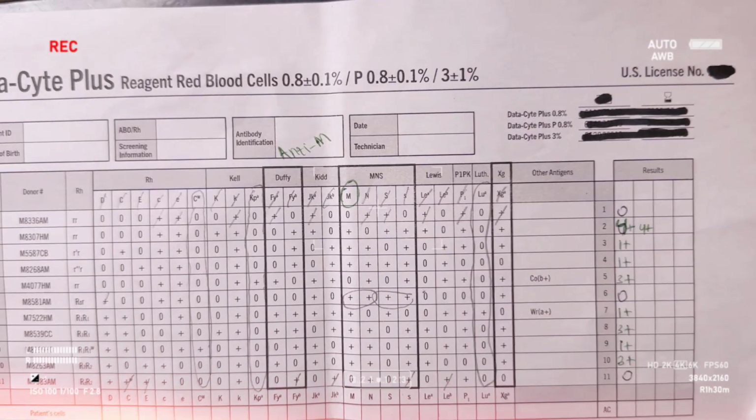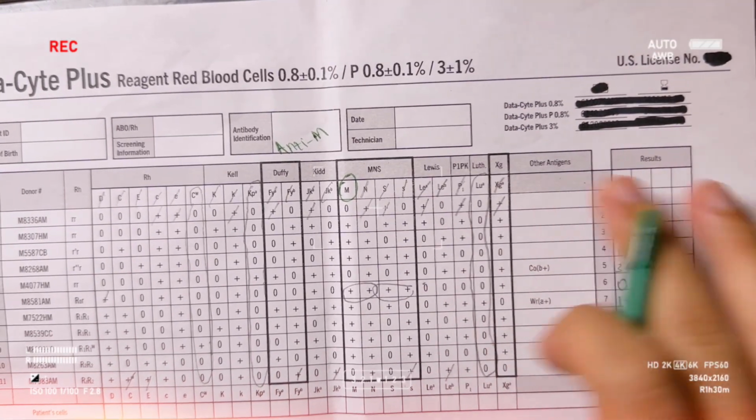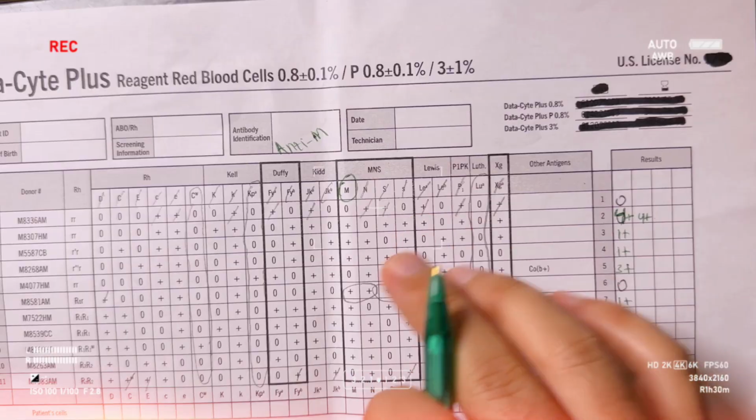So we were able to rule out everything except the M, so our antibody is anti-M.